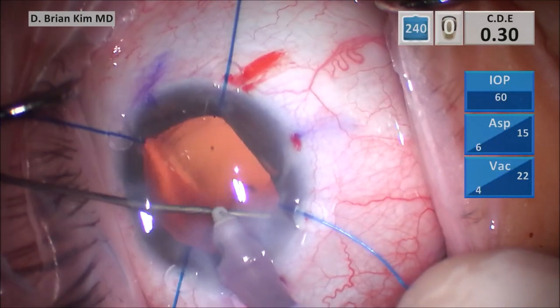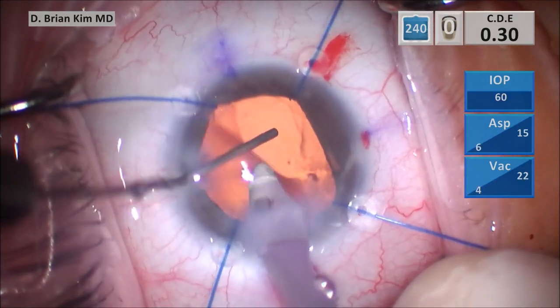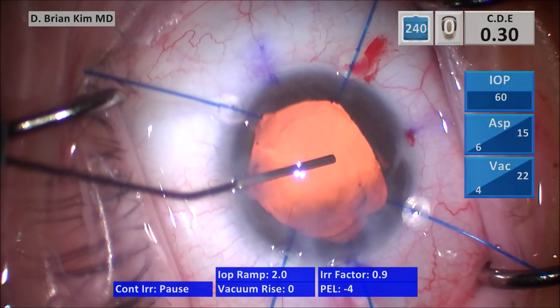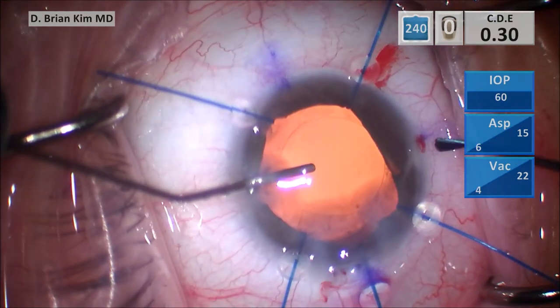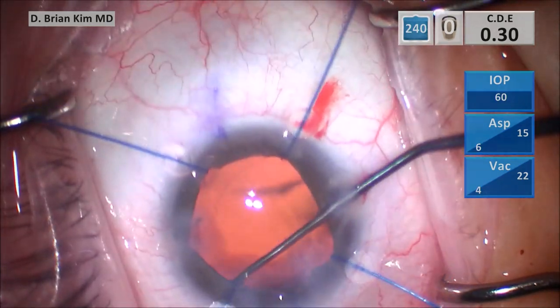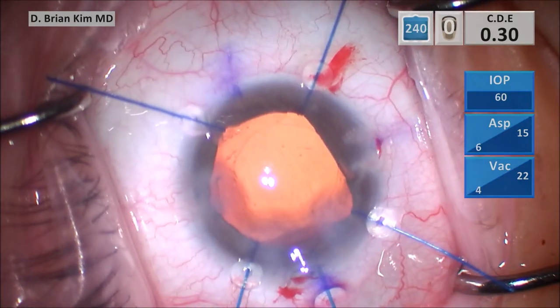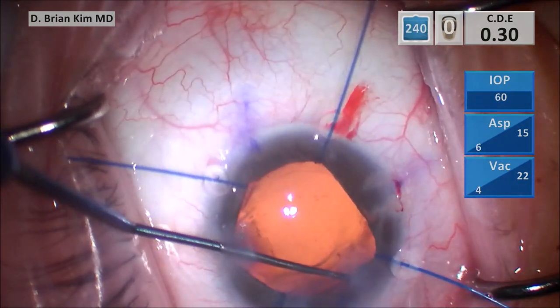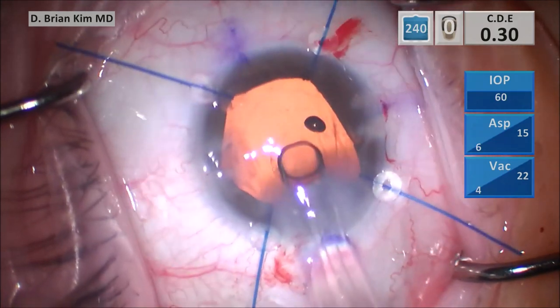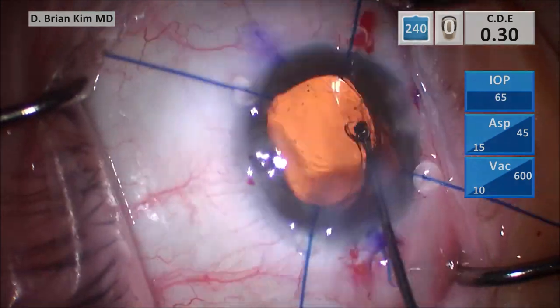I use a BSS cannula to pulse some BSS pressure into the sub-incisional capsular fornix — you can see there's a little bit of cortical material there. I then inject cohesive viscoelastic into the capsular bag and sweep the sub-incisional space with the sweeper to liberate any potential hidden cortical material. I also polish underneath the anterior capsular surface on both sides, removing any lens epithelial cells as well as any potential cortical material. I then inject the single-piece acrylic lens into the capsular bag and use the sweeper to ensure the haptics are not adherent to the optic and that both haptics are within the capsular bag.